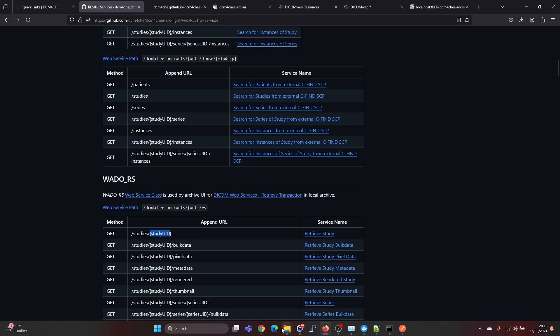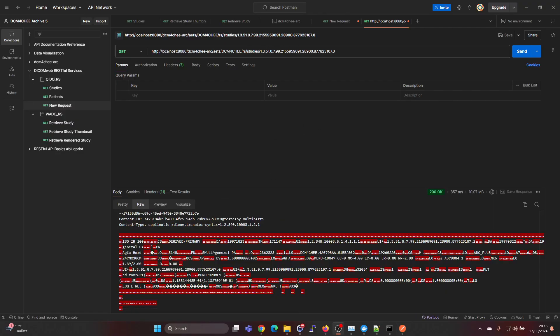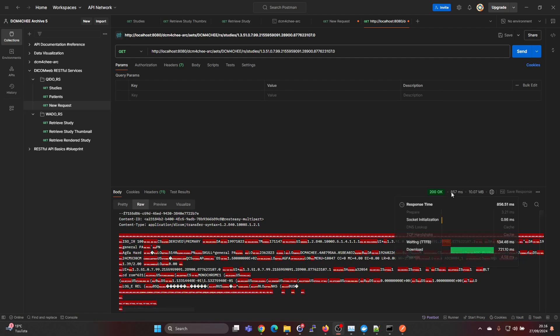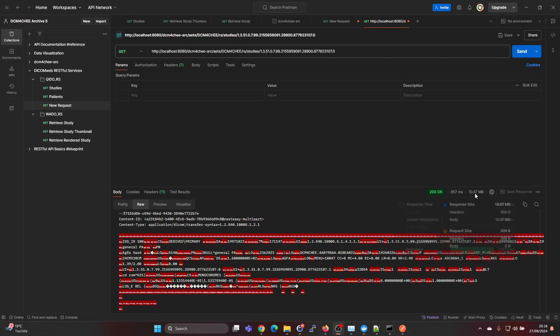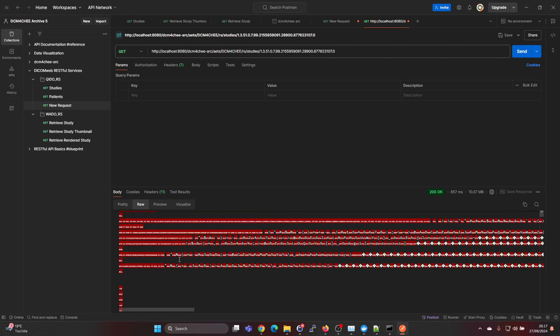What we just did in Postman is retrieve the study. We can see that returning it took 857 milliseconds and it was 10 megabytes in size. Here in the raw view we can see that it's in format application DICOM and that's the binary data below. We can see it says Agfa and so on.